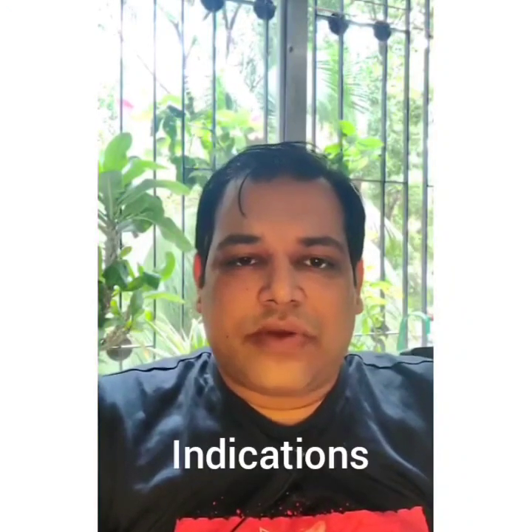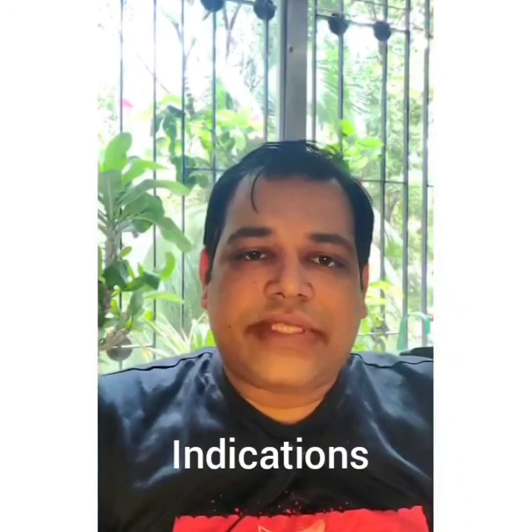So first of all, when do you initiate invasive ventilation? As the name suggests, invasive ventilation means we have to deliver positive pressure breaths, which include air as well as oxygen, into the patient's central airway. This can be via an endotracheal tube or via a tracheostomy tube. These are the two methods through which we can invasively deliver the breaths.